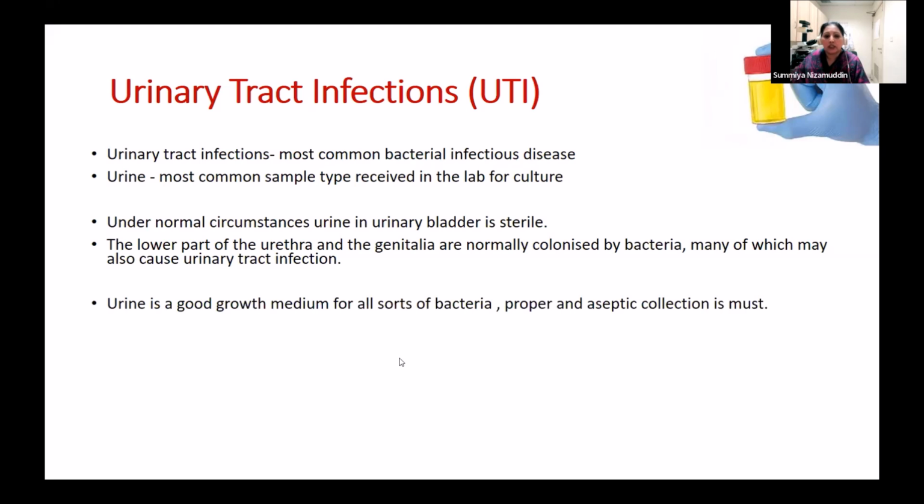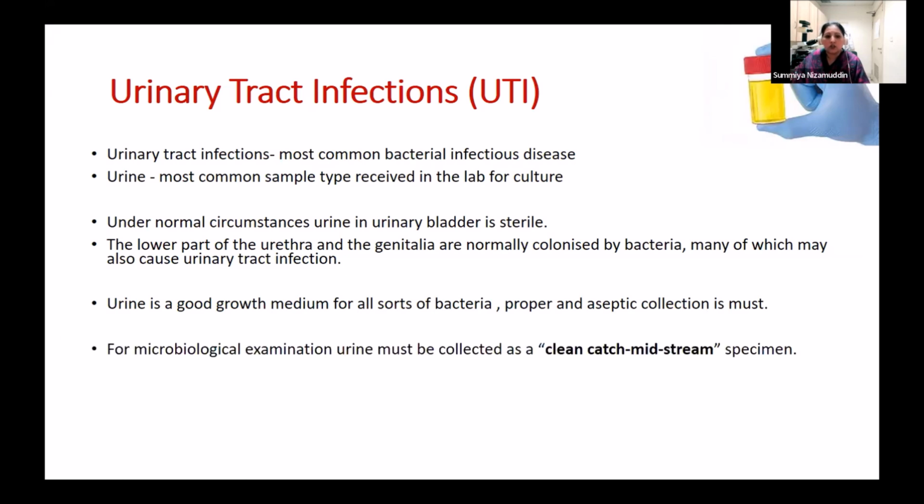Now, urine is a good growth medium, and it supports the growth of all types of bacteria. So it is a must that the sample is collected properly and aseptically. For microbiological cultures, it is recommended that a clean catch midstream urine is submitted to the lab.